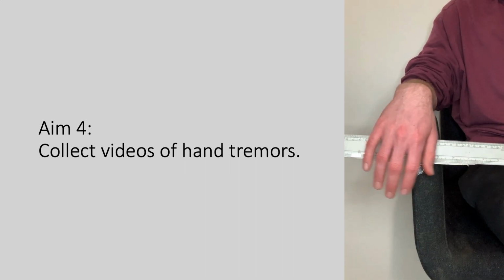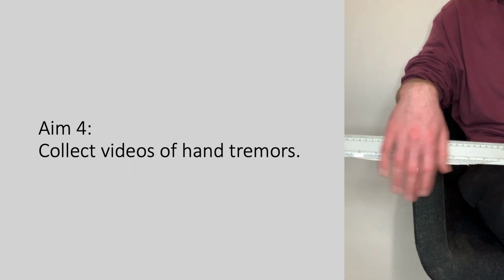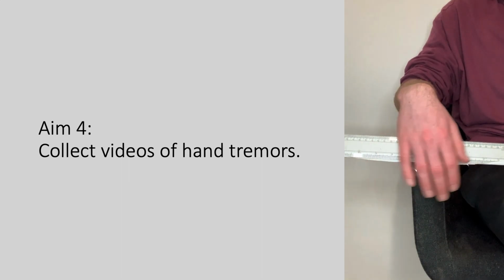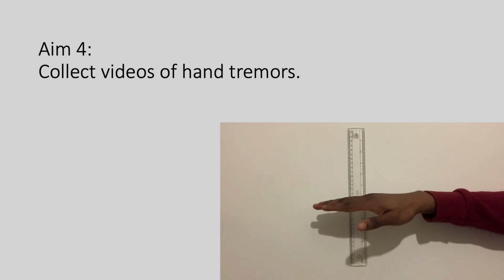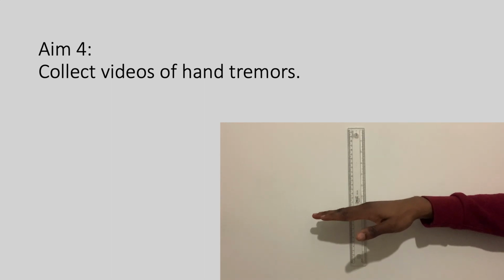These were recorded at a variety of depths, with a variety of different tremor amplitudes. Videos of resting tremors, like the one you can see here, were recorded. Additionally, videos of postural tremors were recorded. In total, 66 videos were collected, each with an accompanying depth measurement.